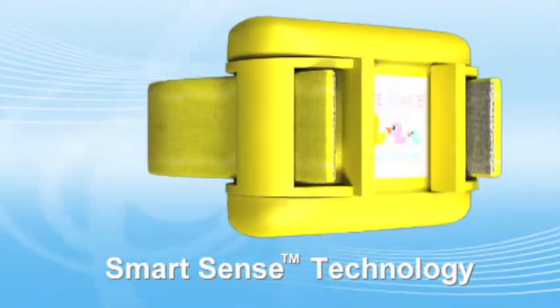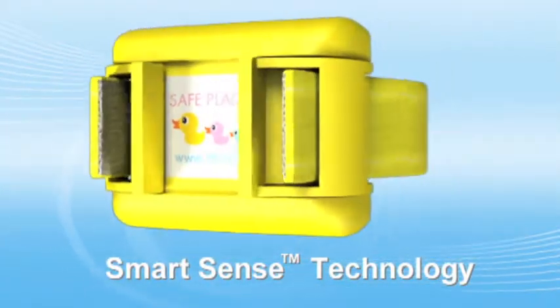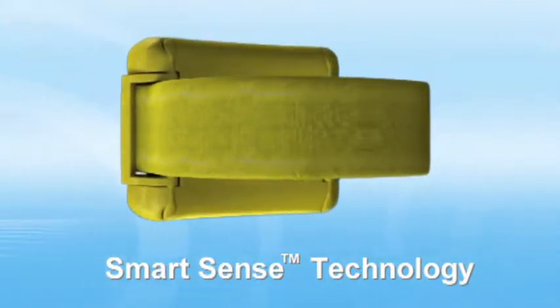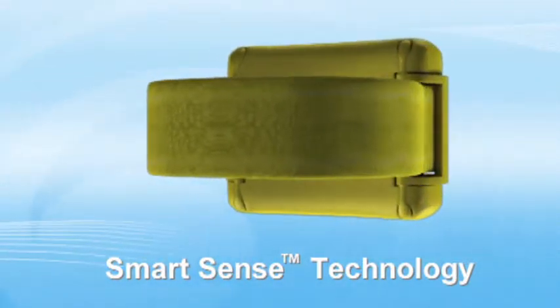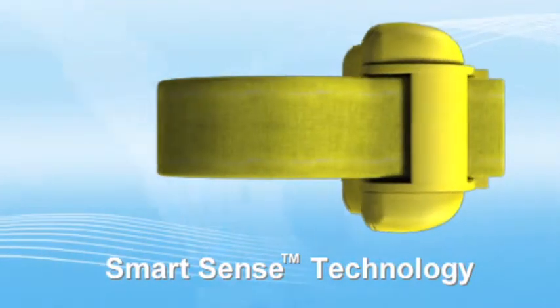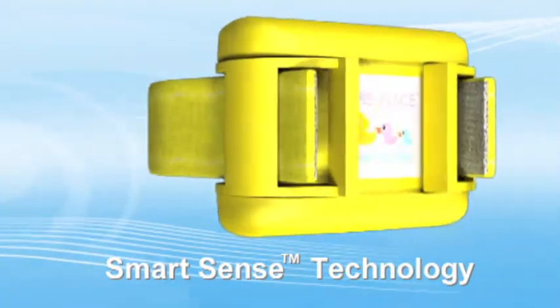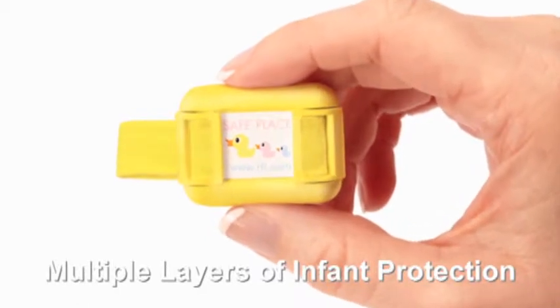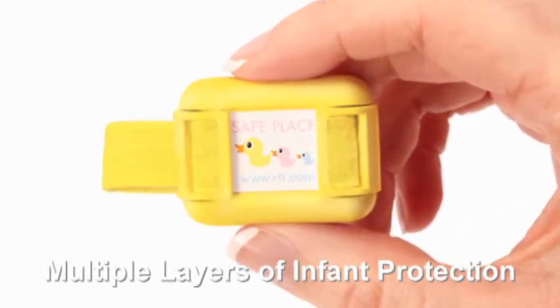The combination of the new SmartSense transmitter and banding material is a cutting-edge technology that has the capacity to recognize if the transmitter has been removed from an infant. It will also sense if it is tampered with or is loose. SmartSense technology utilizes multiple measurements to provide the highest level of infant security.